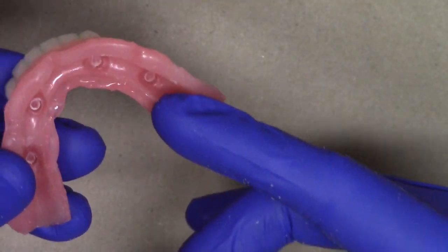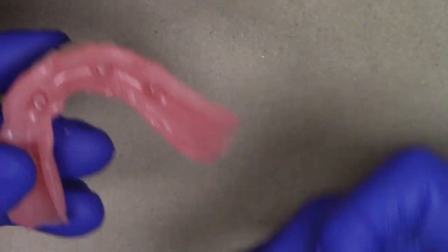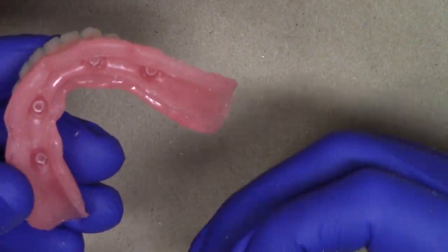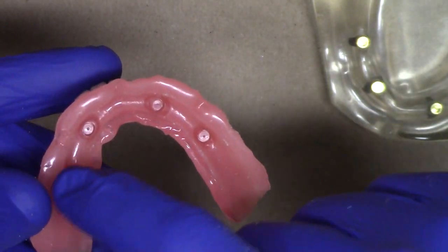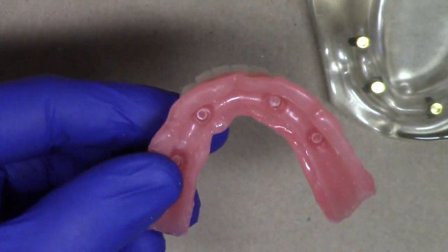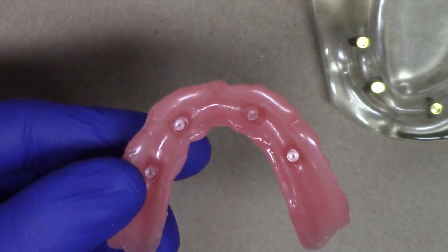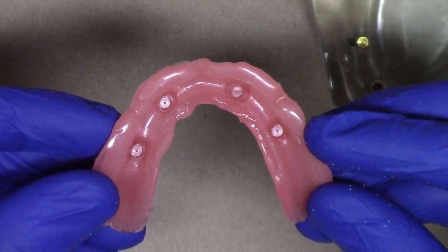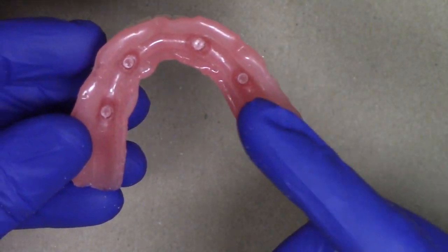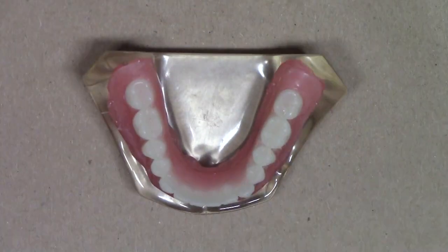Now, because it remains soft, the CHAIRSIDE Soft Reline Material is going to impart a significant amount of less direct force to the implants. If you want to be even more cautious, you could of course hollow out using your coarse adjusting burr on the inside of where the locator abutments is, ensuring that you have no contact with the locator LODI abutments. However, I haven't really seen that being a problem in my office. I like to keep it just like this, seat it back in the mouth, and complete it just like that.